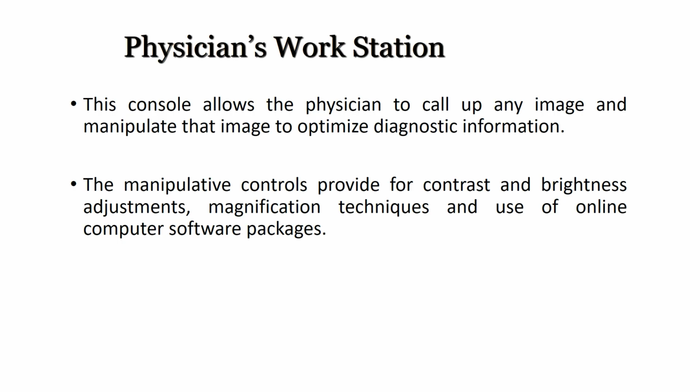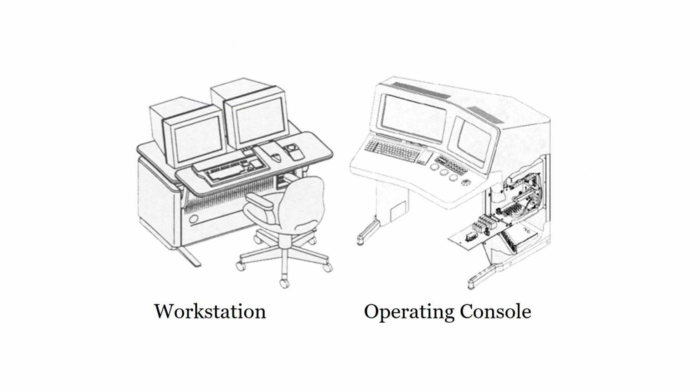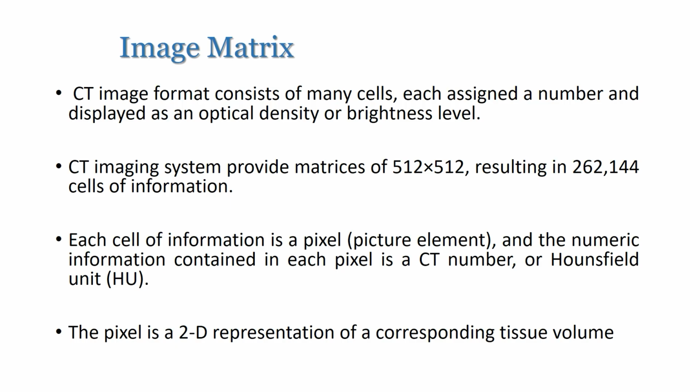The manipulative controls provide for contrast and brightness adjustment, magnification techniques and use of online computer software packages like DICOM software. This slide is showing the operating console for the radio technician in a console room.